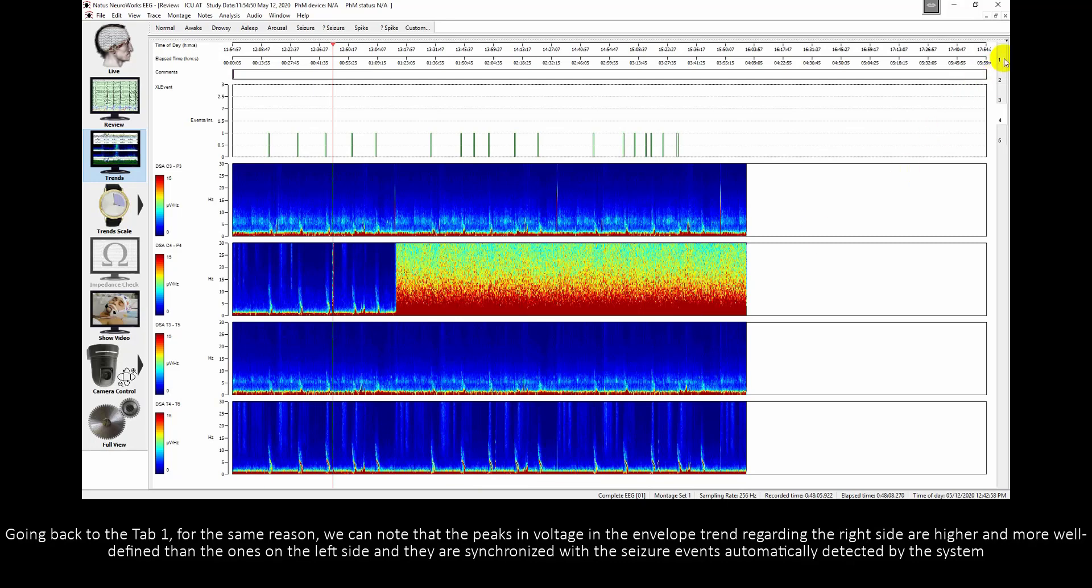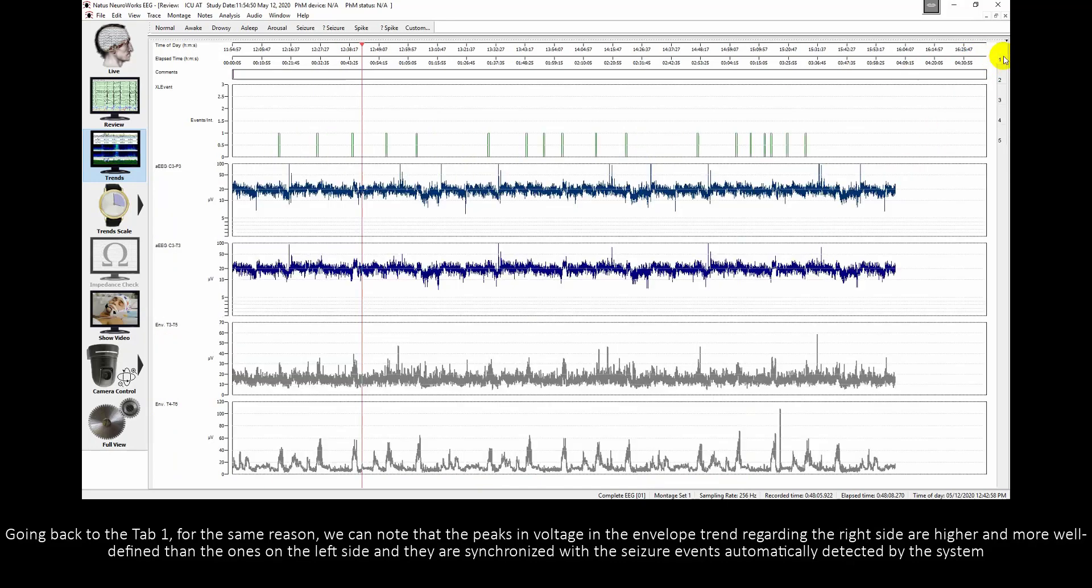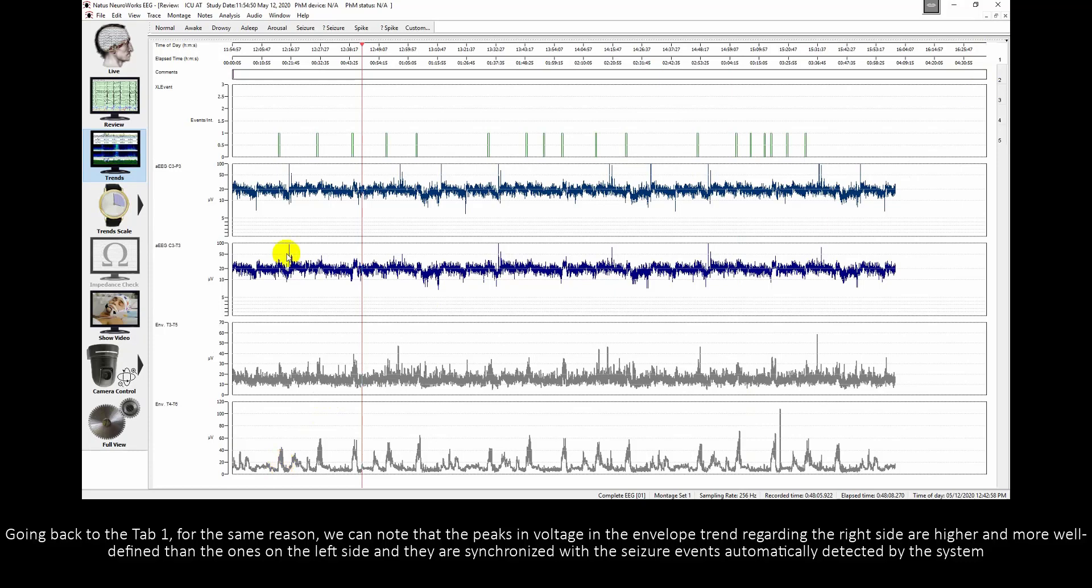Going back to tab 1, for the same reason, we can note that the peaks in voltage in the envelope trend regarding the right side are higher and more well defined than the ones on the left side and they are synchronized with the seizure events automatically detected by the system.